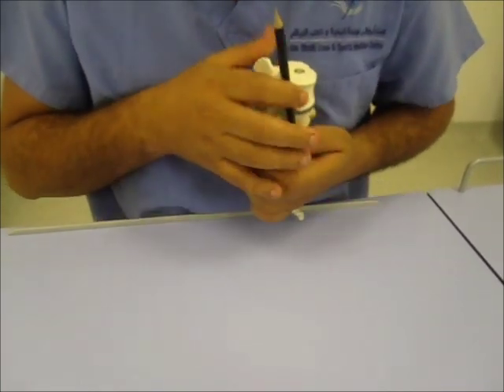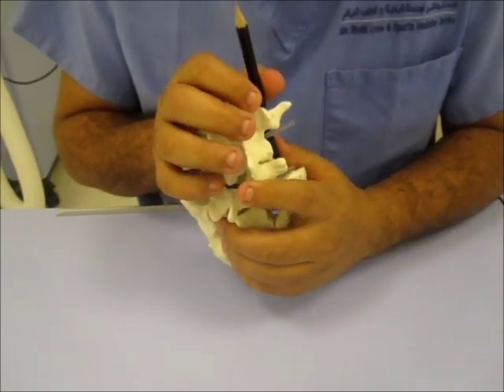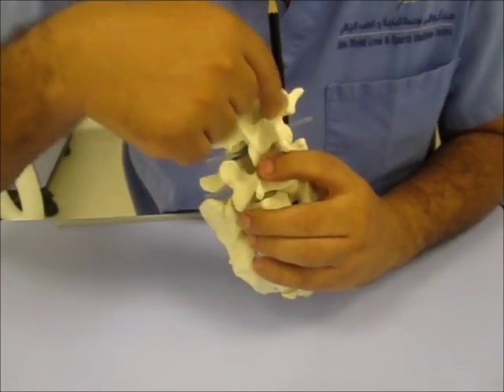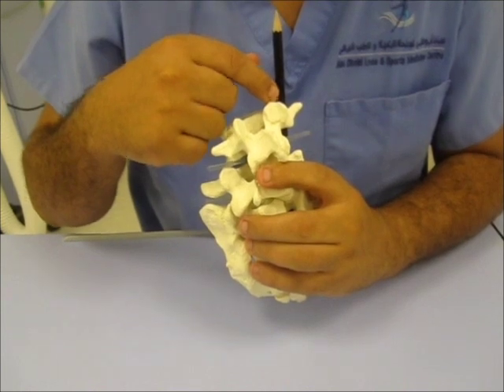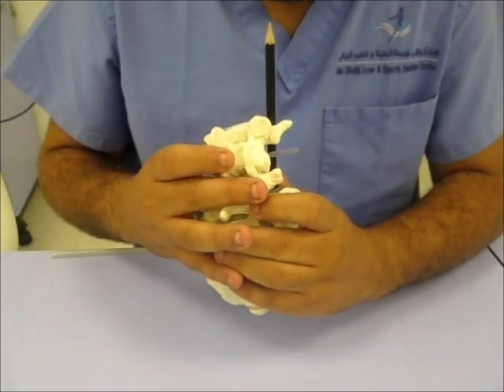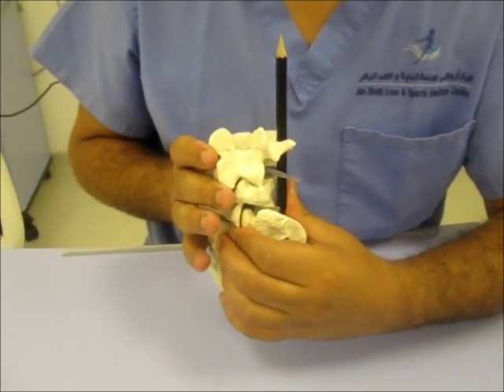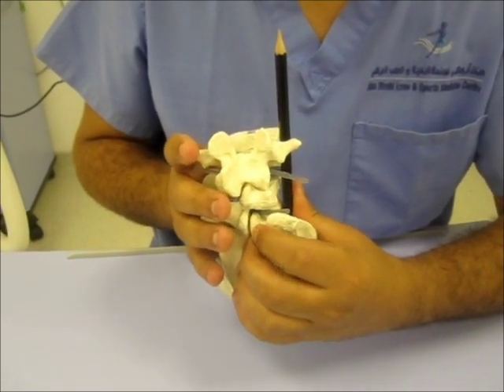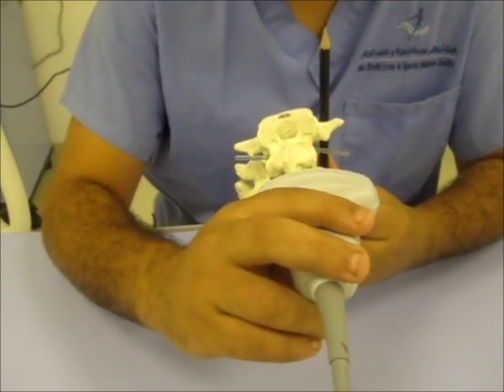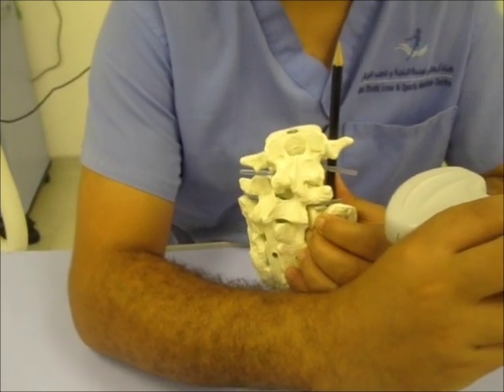Unfortunately, when you try to see it with the ultrasound probe like this, the bone structures here hide the Lumbar Plexus. What we do? We do one trick. We go with the ultrasound probe and tilt the body like this, so we look at it from a posterolateral view. To achieve the posterolateral view, you go lateral and then rock the ultrasound probe medially.